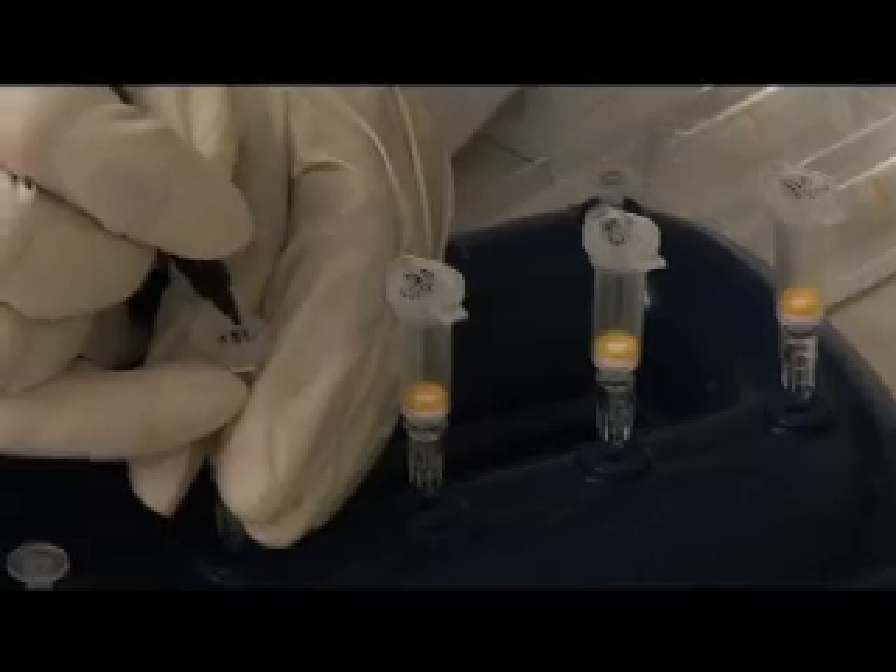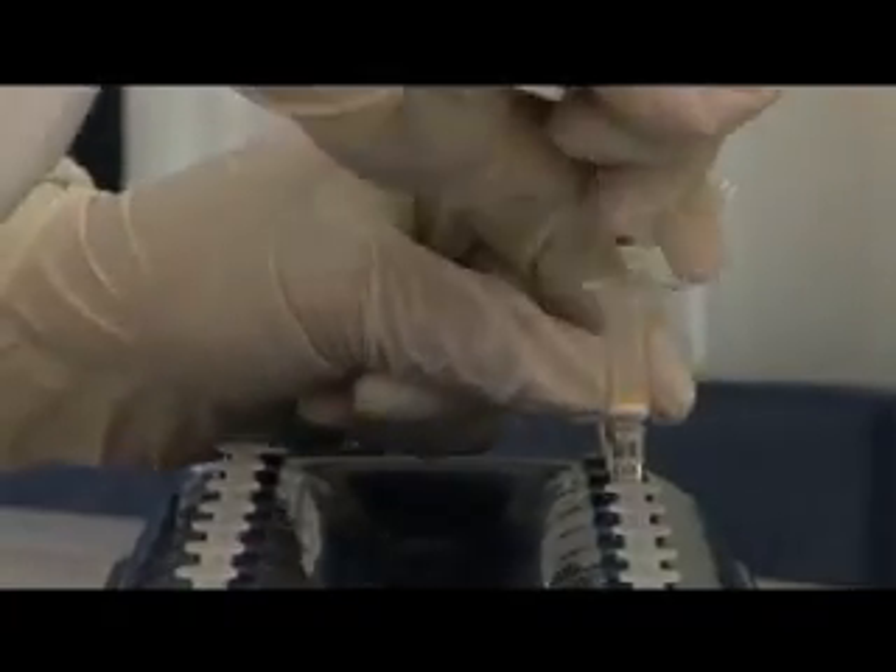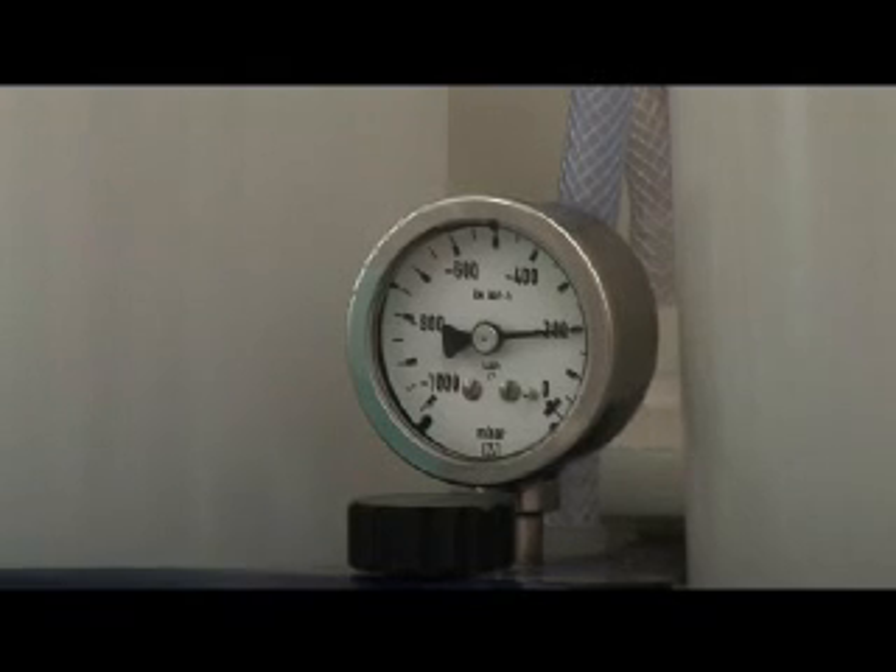Roche Amplilute liquid media extraction kit is recommended. This is a silica-based DNA extraction method providing uniformly high yield and the DNA is pure enough for the subsequent manipulation.